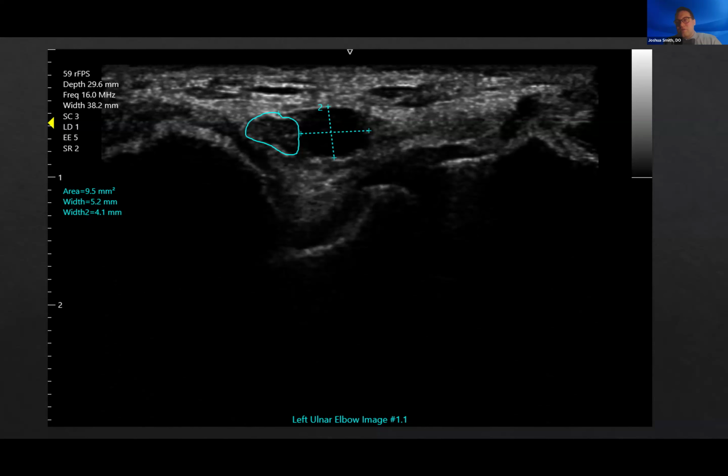If I did an EMG nerve conduction study and could do an ultrasound right now to help your surgeon know what's going on, or you could wait a month to get an MRI that's going to be vastly more expensive than ultrasound, I say get the ultrasound. Just cool gel, a picture, and it's easy. And maybe another thing: what if this person had a pin in their elbow? MRI is also less useful, while ultrasound can still give some good information.